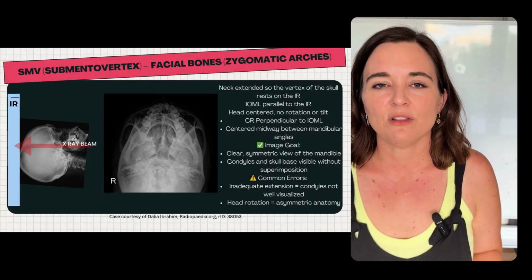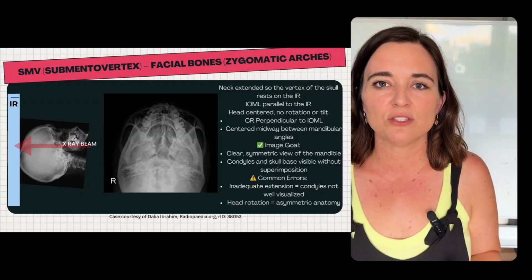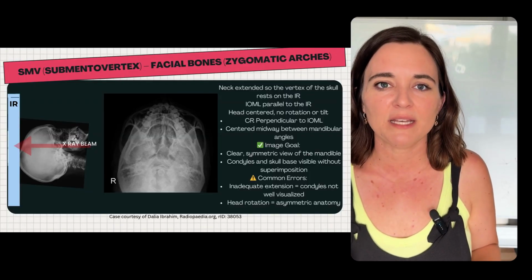When doing the axiolateral oblique mandible series, always combine head tilt and tube angle to maintain an open IP line and keep anatomy crisp.